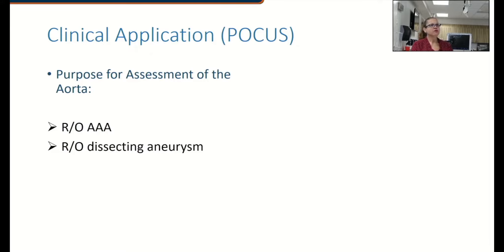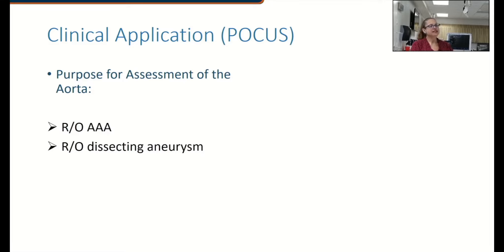The purpose for assessing an aorta is primarily to rule out an abdominal aortic aneurysm, which would typically be a fusiform aneurysm found in the distal aorta, or to rule out a dissecting aneurysm, which generally occurs in the thoracic aorta but does occasionally reach as far distally as the abdominal aorta, where we have seen them on occasion.